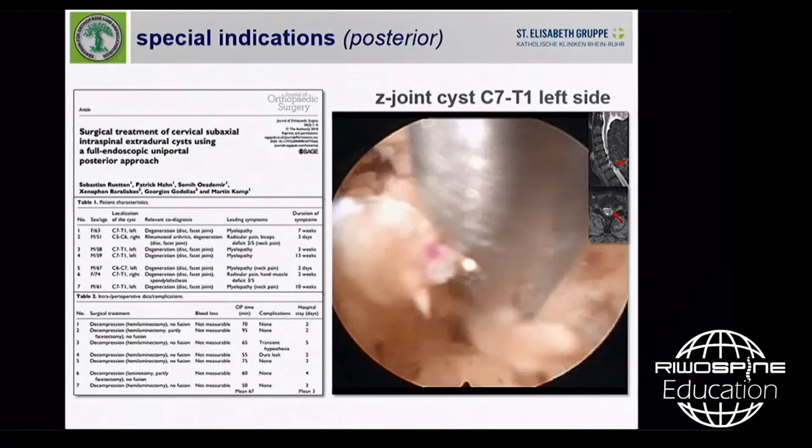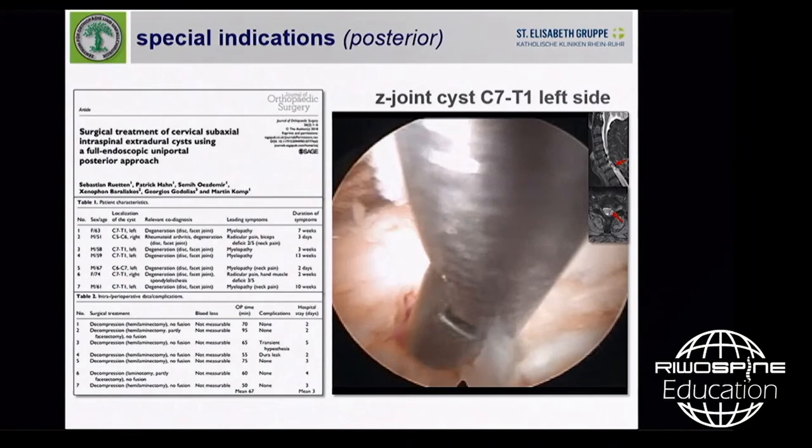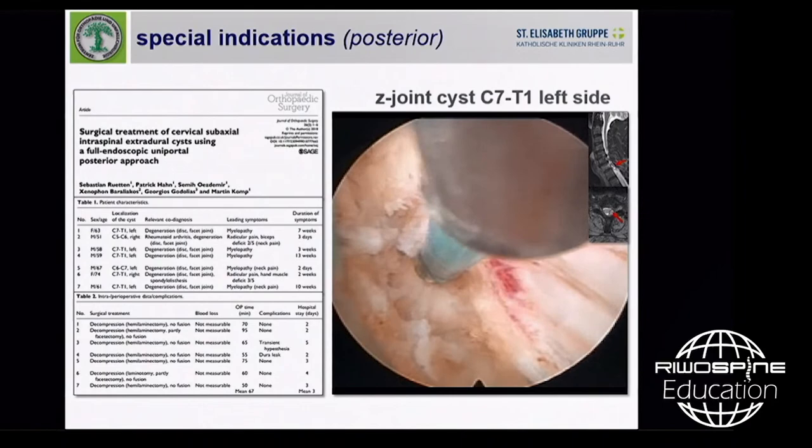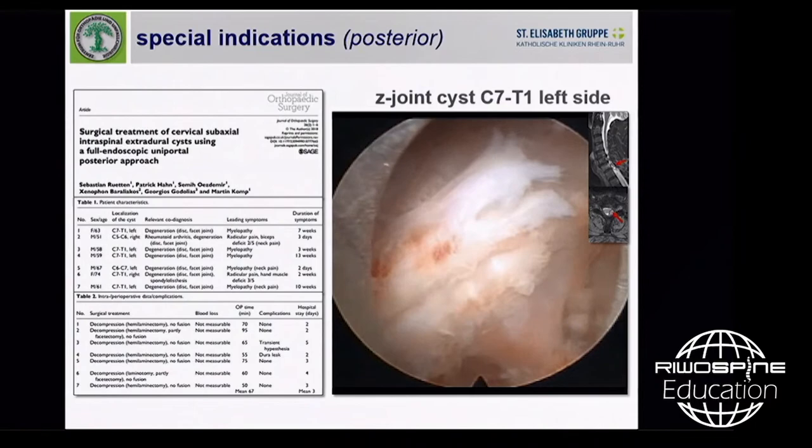Then step by step, we prepare the cervical nerve or cervical nerves, with resection of the last tissue of the cyst. So, dura of the cervical myelon, that's the C8 nerve here. Here was the cyst on the cervical myelon. Rotation to the cranial aspect, that's the C7 nerve. And here starts the C6 nerve.